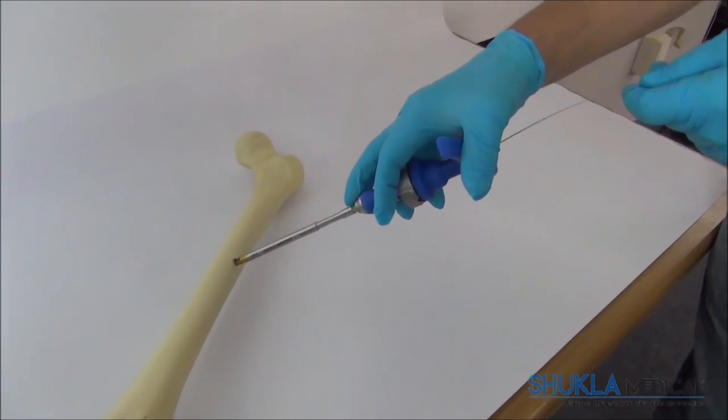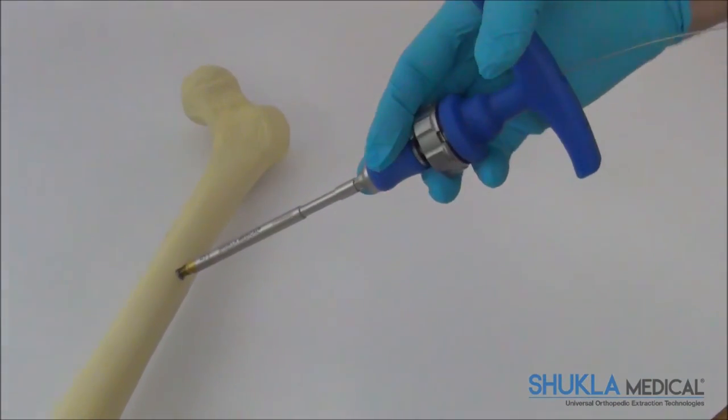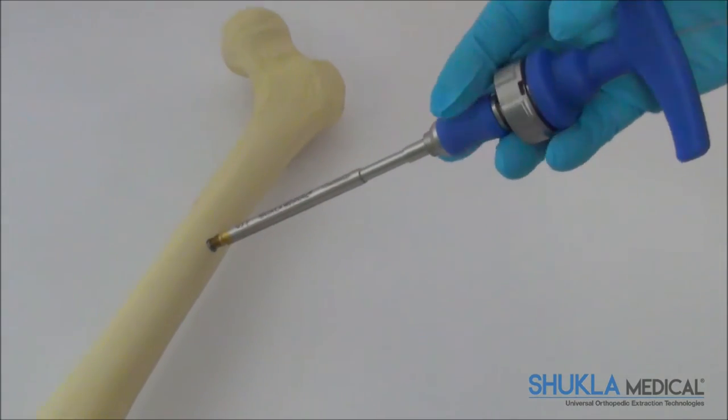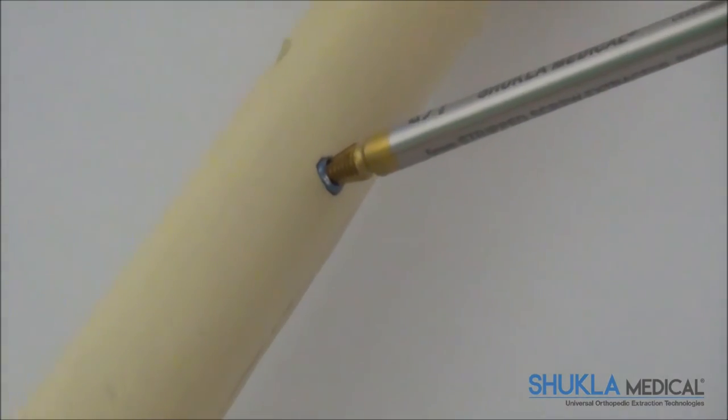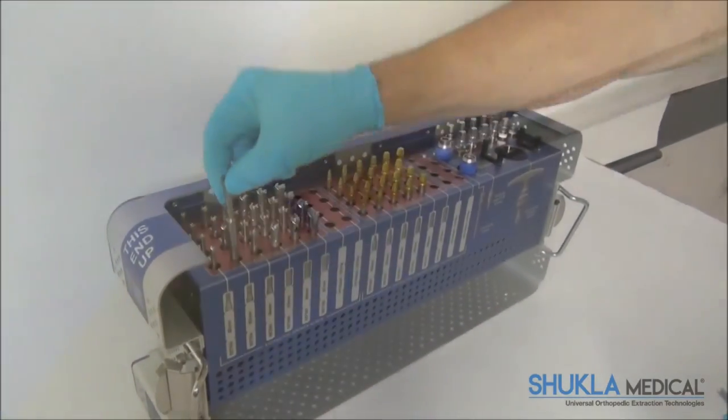The broken and stripped screw extractors, except the 2mm stripped, are cannulated to either allow the surgeon to follow a K-wire down to an embedded screw or guide the stripped screw extractor into the well of a stripped screw.